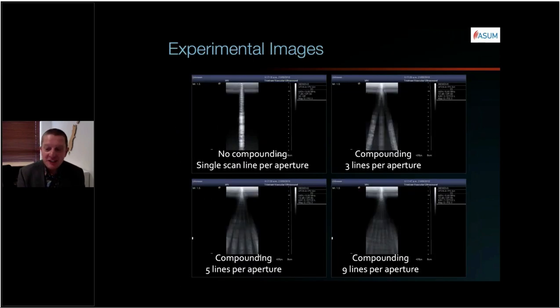On many ultrasound machines, you can do a lovely experiment to see how image compounding works by placing a metal pin, for example, a paper clip, on the transducer surface, and that paper clip will cause a ring down artifact on the image that you can see. In the first image on top left, the pin is resting on the transducer, it's reverberating, and that reverberation artifact propagates straight down.